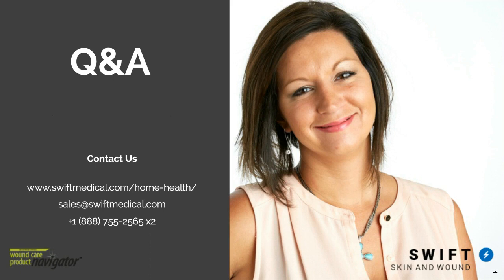Thank you. Do you see or know of any specific cases or legal issues pertaining to picture documentation? So we're seeing accuracy and consistency with using a digital wound management solution. This is being used to combat litigation in multiple settings. We know that those families are going to be taking a picture. A picture says 1,000 words in a litigation setting.